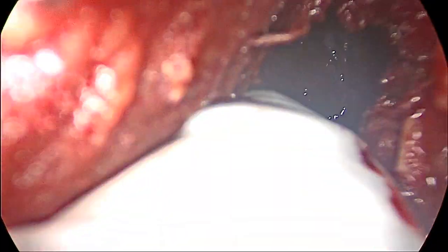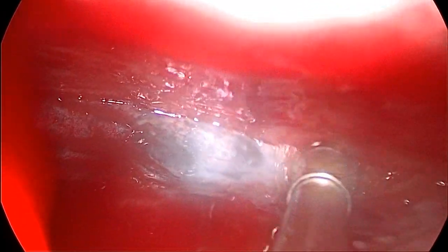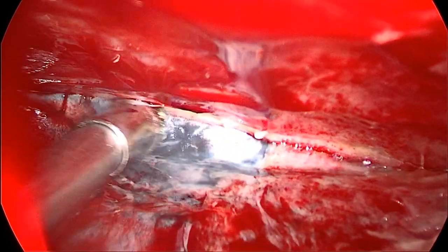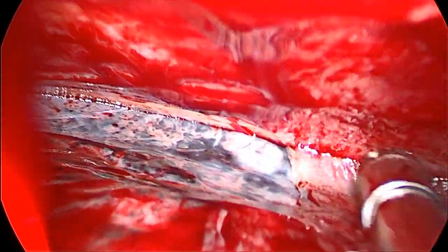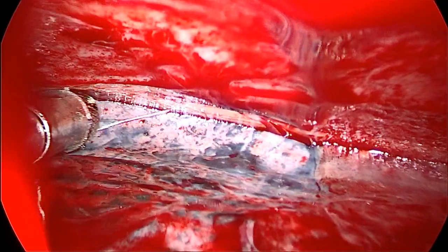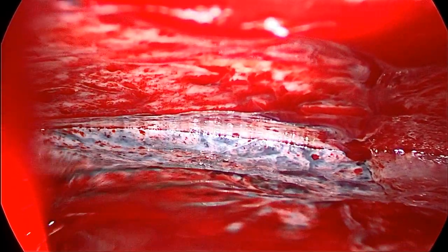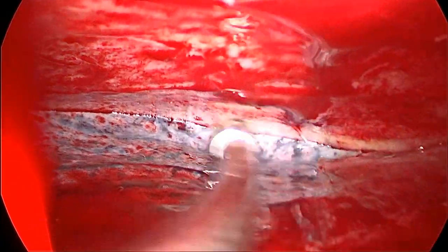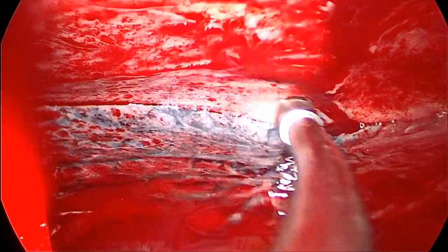We plan for a wide uniportal thoracoscopic procedure. Port location at the fifth intercostal space, mid-axillary line. We start at a fresh area away from the empyema pouch.